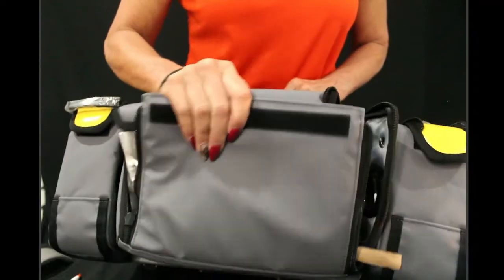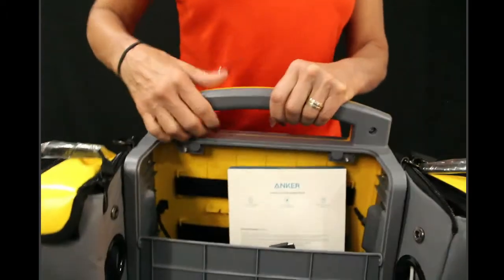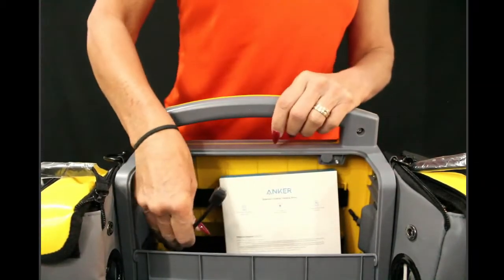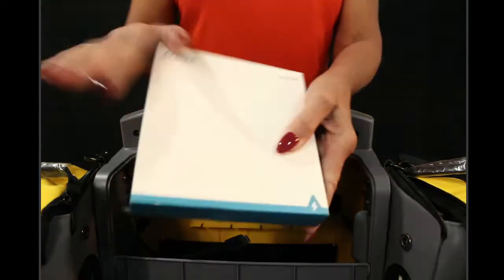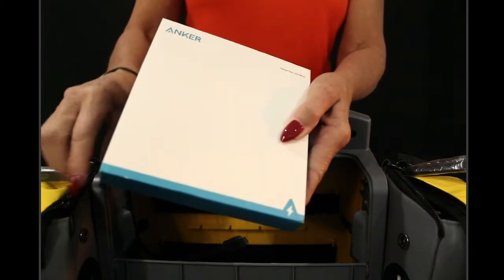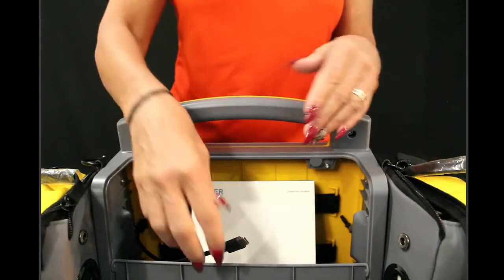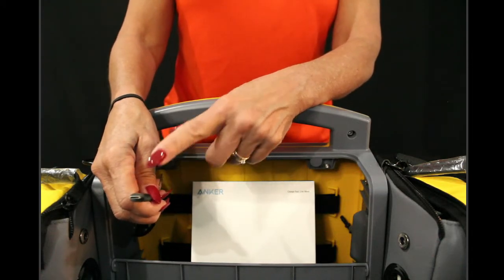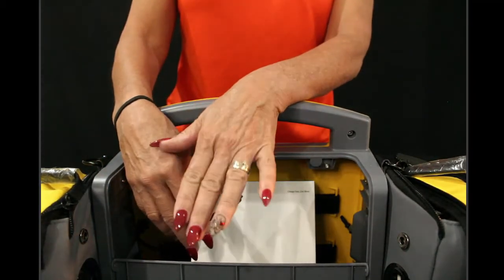Taking off that compartment reveals another area you can open up, and this is where you're going to find your control pad, the charging cable for the monitor, and another portable charger. Because the router has to be plugged into a power source, if you need to take this on the road, you can plug the router into this portable charger and take everything on the go. The charger from your accessory pack is what you plug into the wall to charge this portable charger when it's not in use.